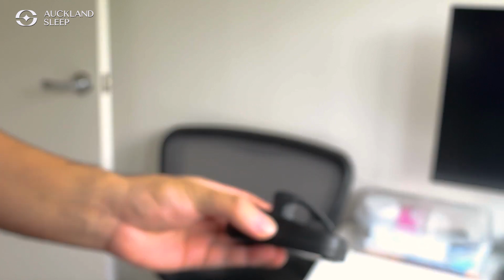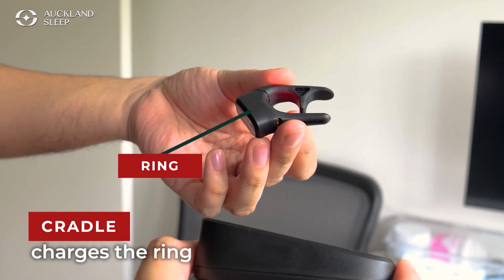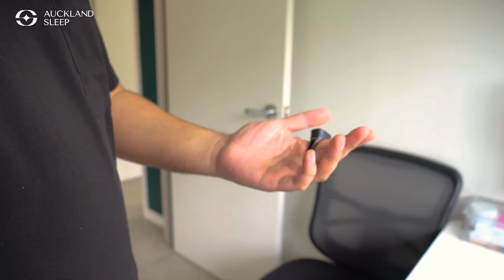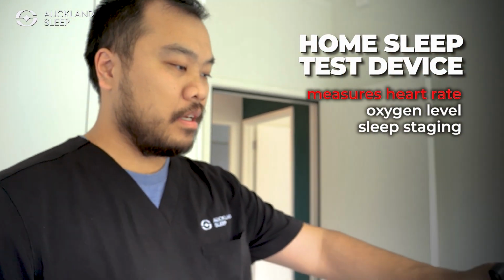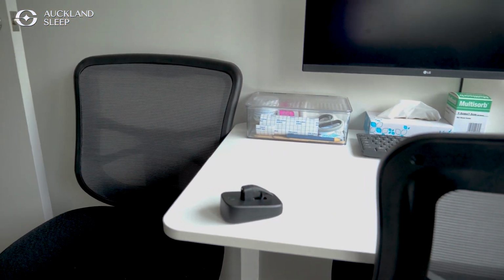So the device has 2 parts. The bottom bit there is called the cradle, and the cradle charges the ring, and the ring is what's worn to perform the sleep test. All you need to do, just before you go to sleep, is put this onto your non-dominant index finger, like so. It's pretty comfortable, just like a ring. So that's worn for the whole of the night. This will measure a few things: heart rate, oxygen level, and can help with sleep staging. So I think there's a big misconception about potential discomfort of doing a sleep test, but it's a pretty seamless, comfortable experience as well.